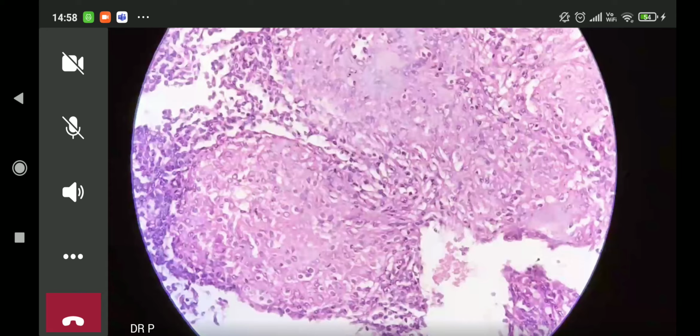All the nuclei that you can see in this particular area, they're not lymphocytes. The ones that are very dark, they are lymphocytes. But the ones that are opened up, they don't have any material inside them, and they're slightly lighter staining, they're all histiocytes, okay? So this is how you pick up a granuloma, which is nothing but a response to an inciting agent, which in this case is Mycobacterium tuberculosis.